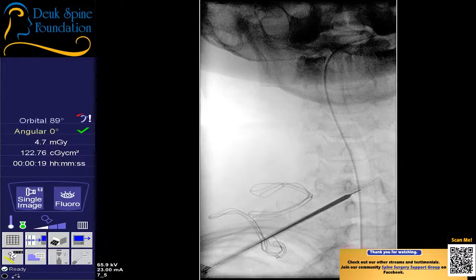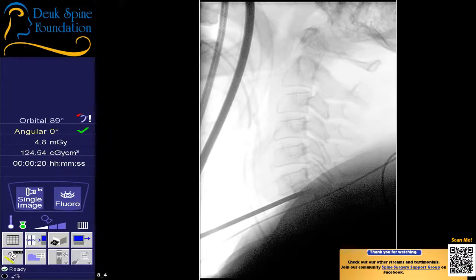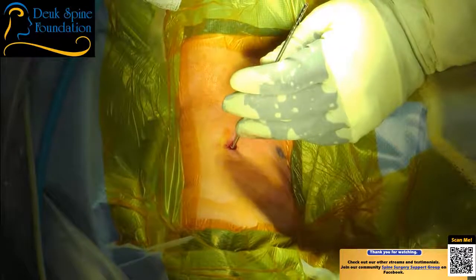So at this point, I'm going to advance the dilator into the disc. So I still need another lateral shot. Yeah, that's perfect. So I'm going to use my fingers to just feel as I go through the anterior. There it is, right through the anterior longitudinal ligament. Shot. Perfect. I'm in the disc so I can take the guide wire out. And I'm going to advance the tip of the dilator to the back of the disc. Shot. Right where the herniation is. Shot.